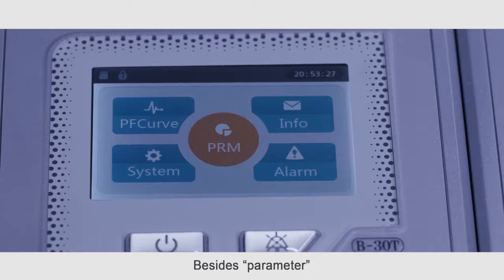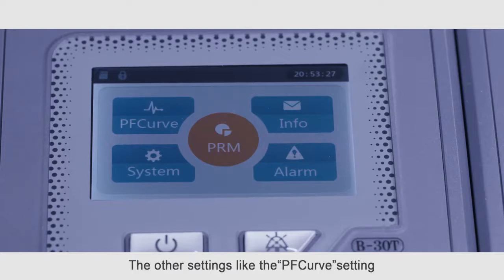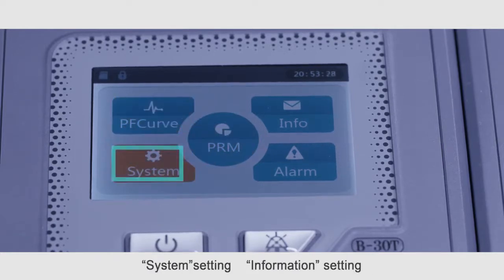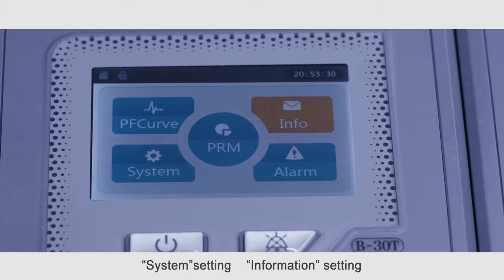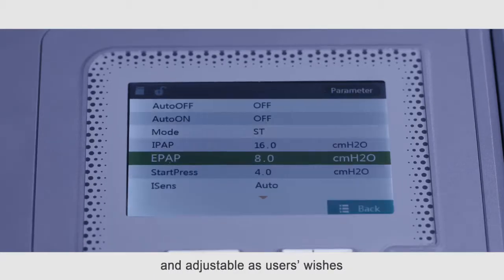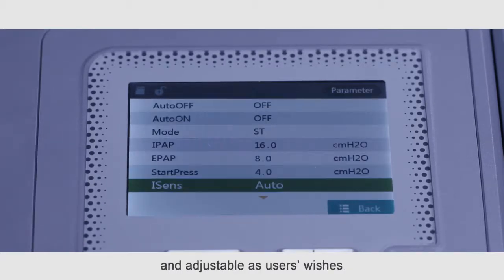Besides parameter, the other settings like PF curve setting, system setting, information setting, and alarm setting are available and adjustable as users wishes.